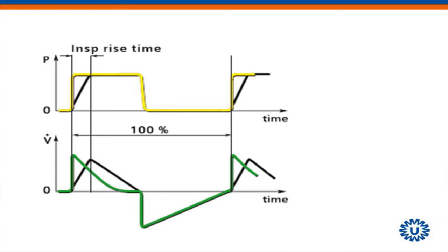It depends on several factors. Tell me. First is the breathing rate. Which breathing rate are you using? Yes. In this patient? Correct. More factors? Flow. Who said flow? Flow, tell.